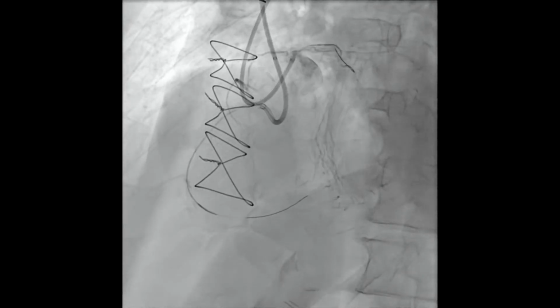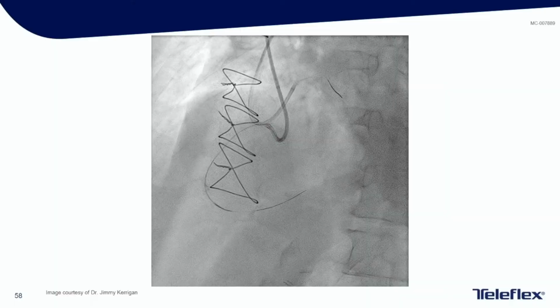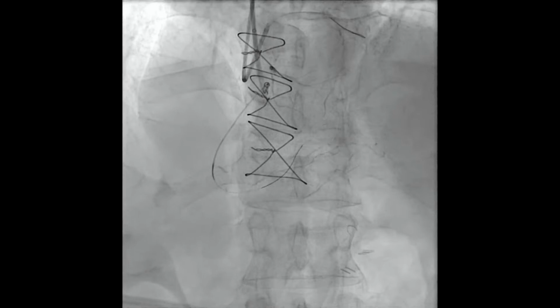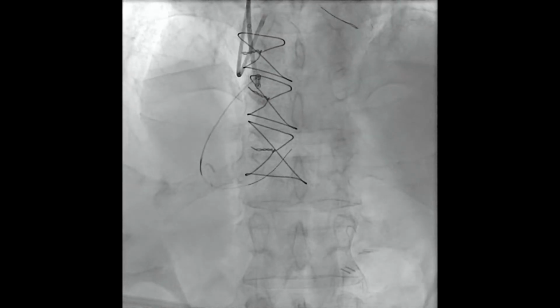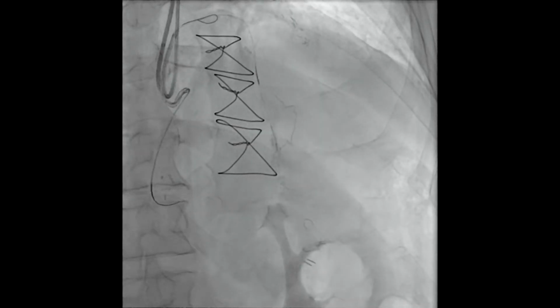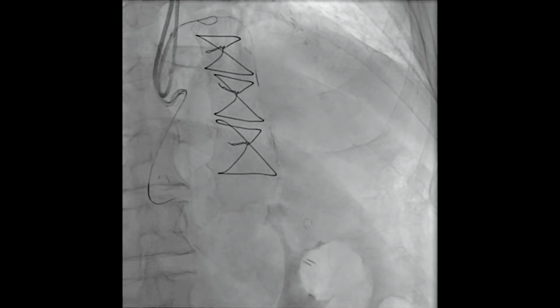So advanced a Turnpike Spiral and a series of wires in our wire escalation pathway. We can talk about that in the Q&A if people want, but never could convincingly enter the distal true lumen on retrograde injection in multiple projections. So you'll see the wire in some potentially small vessel to potentially true lumen, but again, back to the CTO guiding principle of don't follow with microcatheters unless you're sure your wire is in the architecture of the vessel in a good spot. We don't want to cause complications and make the patient worse for a procedure that's truly elective and really just to improve outcomes. So our distal wire wasn't in a great spot, or we weren't sure that it was, so we decided to go retrograde.